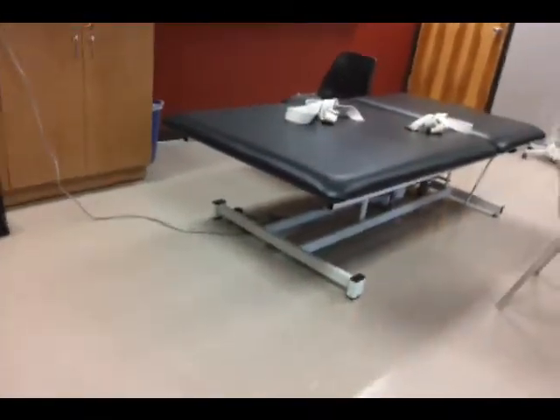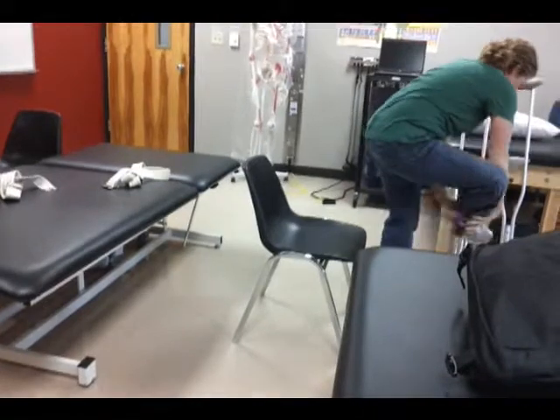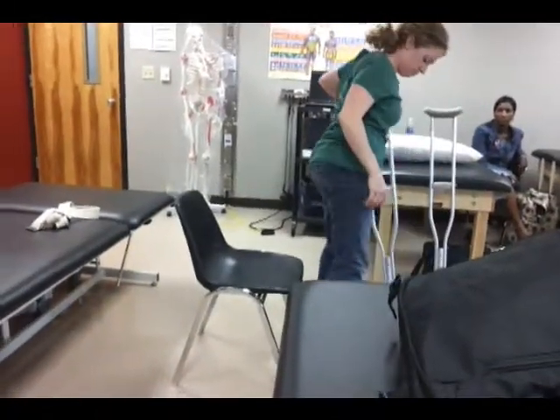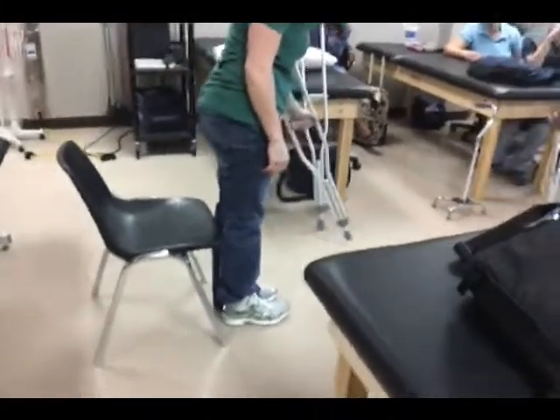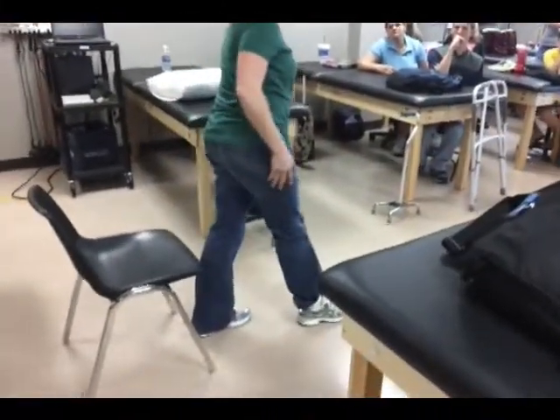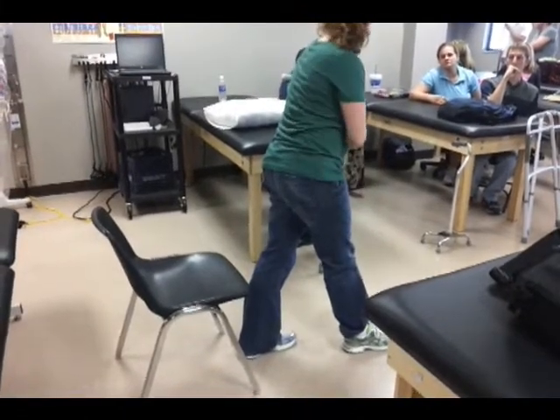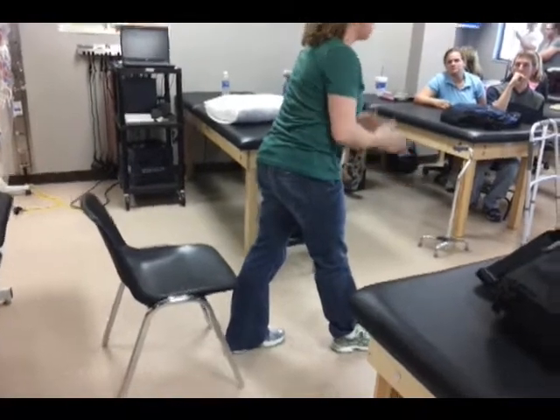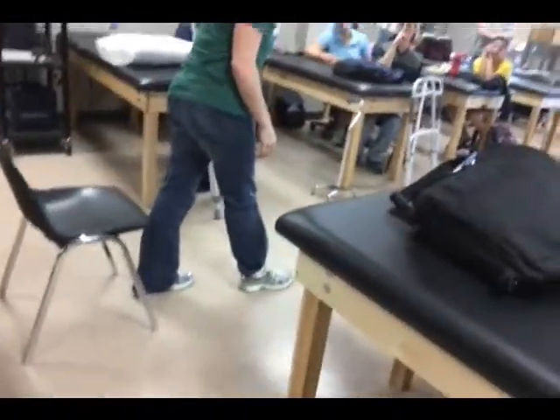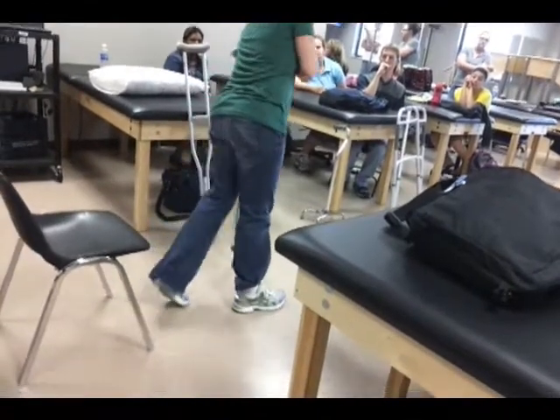Can I use this for a non-weight bearing pattern? No. Only for full weight bearing. But I have one leg that's bad. So, my crutch goes, then the bad leg, and my crutch is always opposite of my bad leg or my assistive device. Why is that? Balance. It helps with balance, it widens my base of support, and because I can't stand the full weight on this, I can shift it off of that.